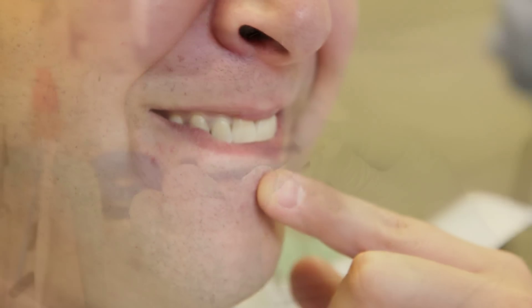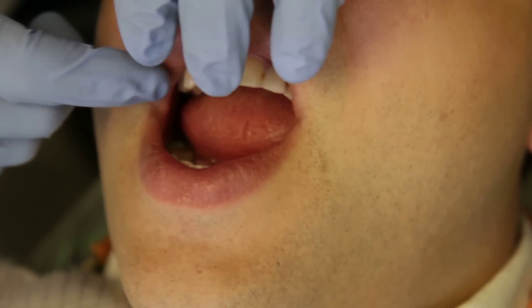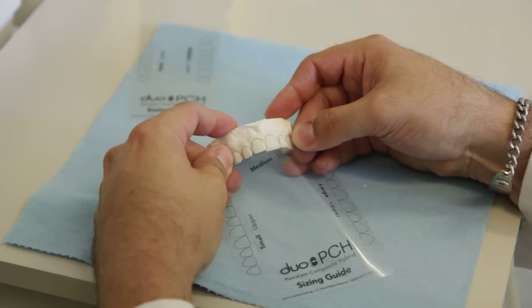For patients that you have limited time with, limited funds, or high finishing aesthetic demands, I found this system to be highly appropriate, easy to use, and fairly quick. I was glad to have the preoperative appointment so that I could take models and use the sizing guide appropriately.